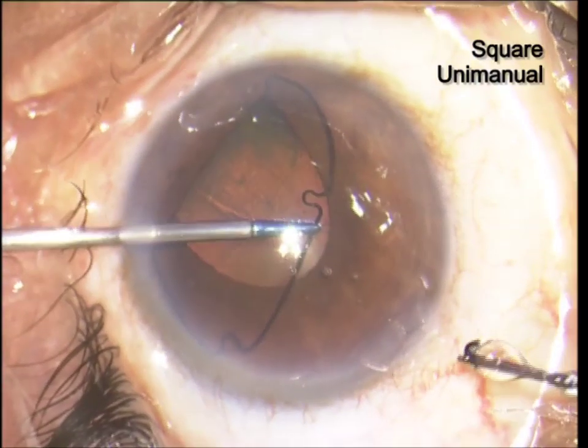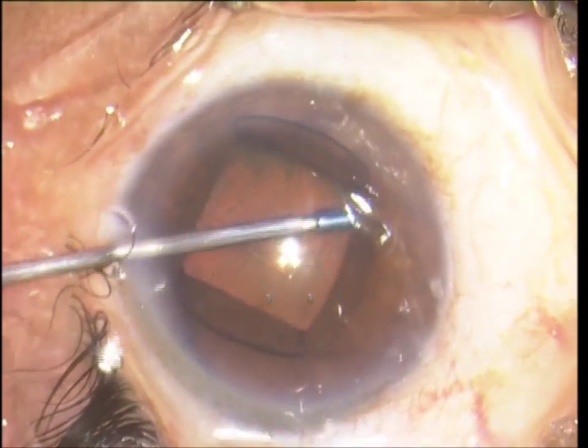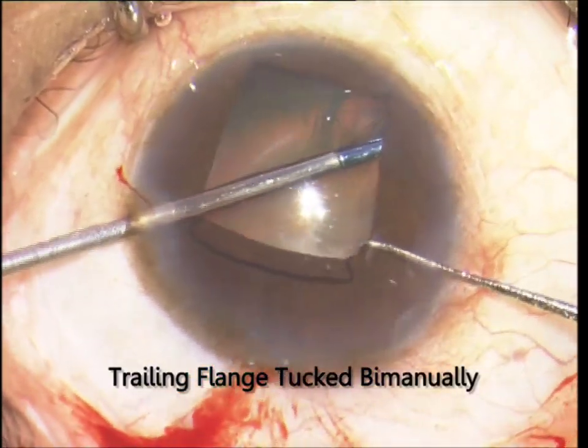The flanges may also be tucked with a 23-gauge forceps alone, or bimanually with a 20-gauge forceps and an iris hook.